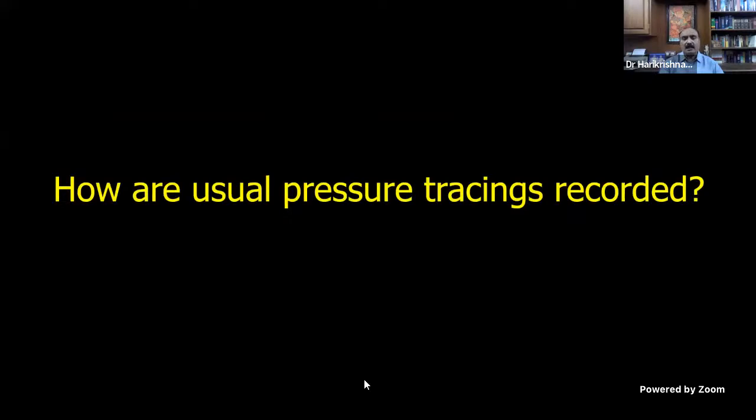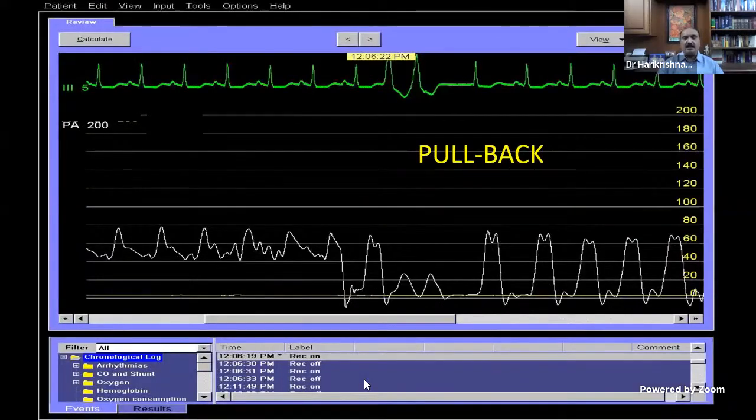So how are the usual pressure tracings recorded? We'll come to the first tracing. Can somebody answer this? This is a pullback tracing. Can somebody analyze it? Simple, nothing great. Abhik, yes.